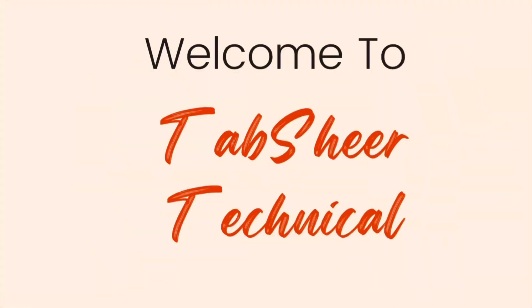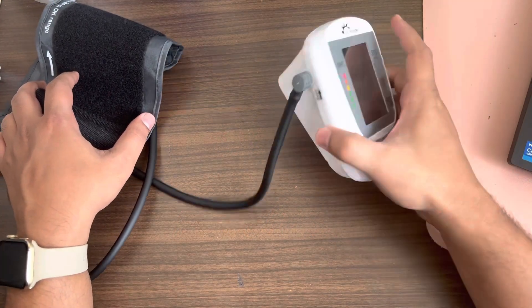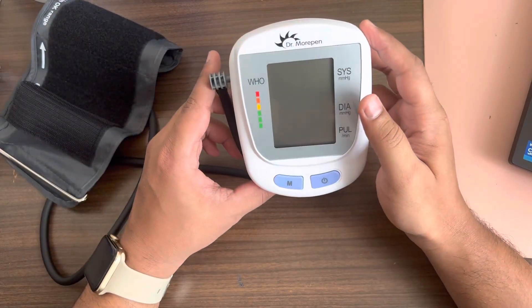I wanted to quickly show how accurate the reading is on both — whether it matches with the actual BP monitor or not. So without wasting any time, let's get into the video. This is the BP monitor I have, it's from Dr. Morepen.